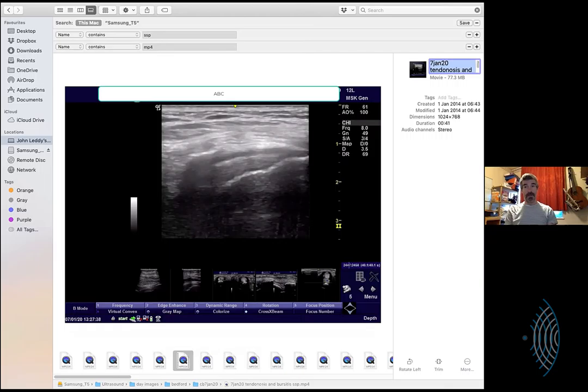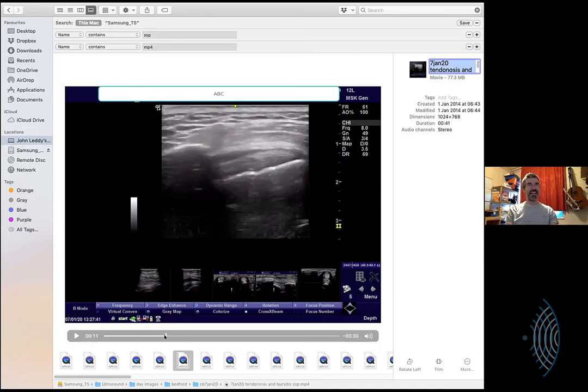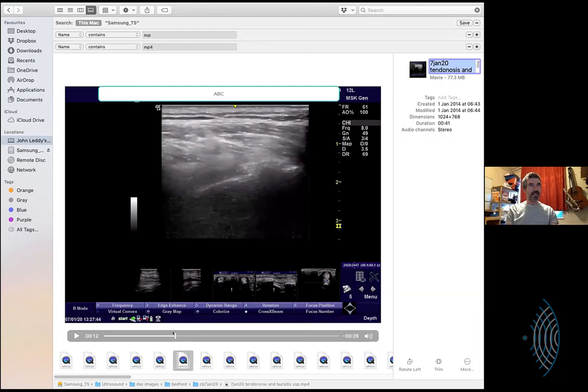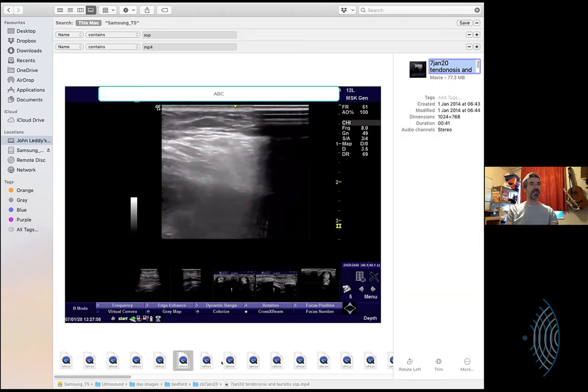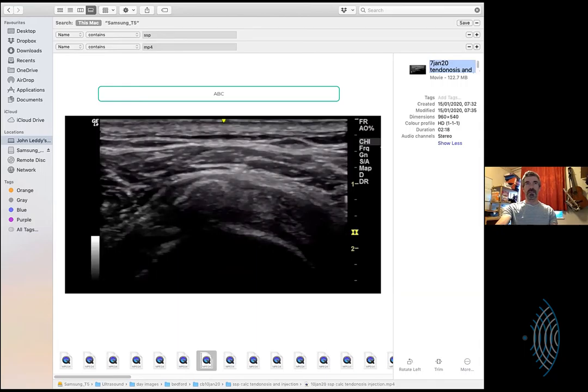It's not absorbing it, but that's me just being pedantic. It's letting it through, just like water. It's probably got a reasonably high water content, but it's not fluid. My brain's got a high water content, but it's not very fluid. Let's see, I think there was one sliver of this where you actually got a little bit of insight into the bursa, but it might not be this video.